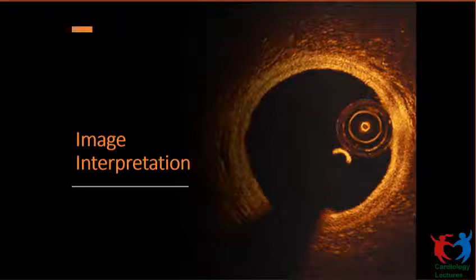I think this is a very, very important question. Number one is, once the catheter is connected to the dock, it has to be left connected. You never disconnect. Number two, what do you do? Because you have a very busy table. You've got bowls with contrast, flush material, gauze pieces, syringes, one bowl with NTG, everything on the table.